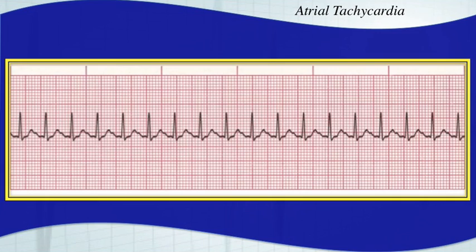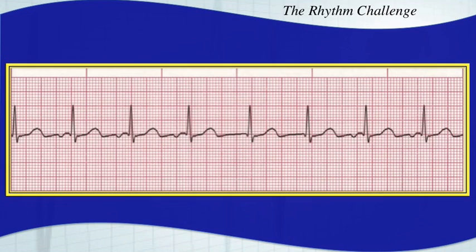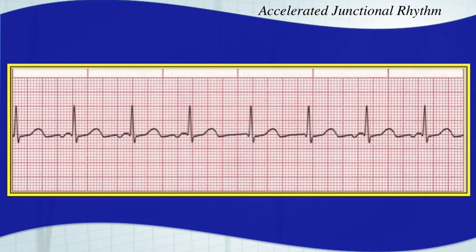As soon as that atrial tachycardia comes off the screen, take a good look at this one. The answer is an accelerated junctional rhythm. You do have inverted P waves here with a narrow QRS complex, and then those go away for a couple beats there.